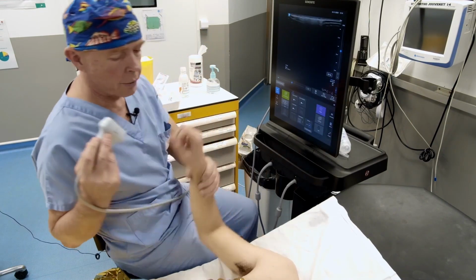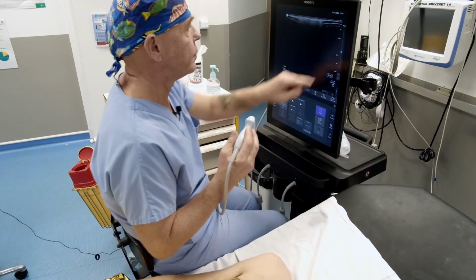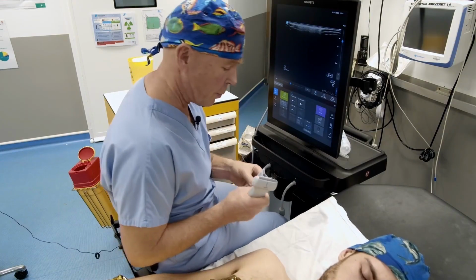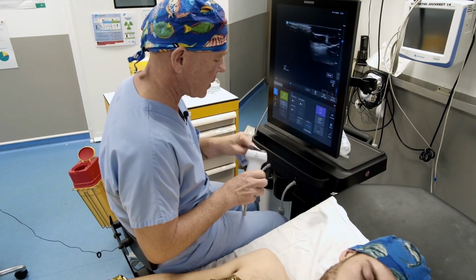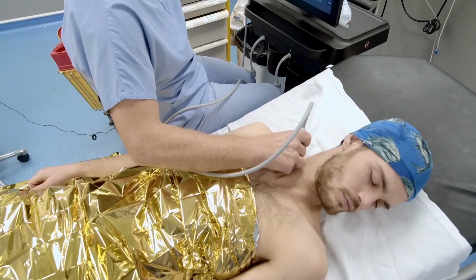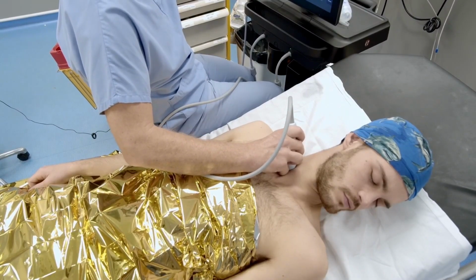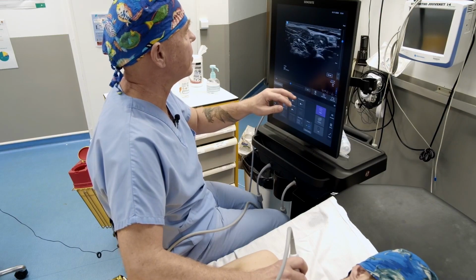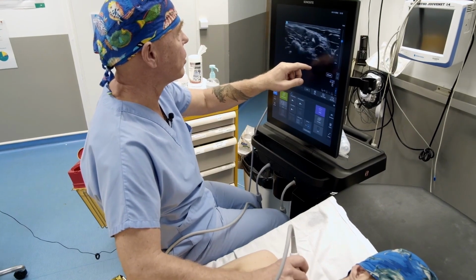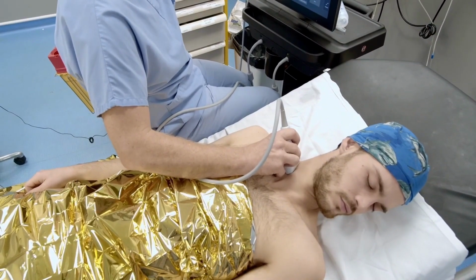So we'll move right along to the upper limb blocks, starting with the interscalene block. For the interscalene block, it's quite simple. You start from the clavicle. You place your probe against the clavicle and move upwards. Here we're live, you see there it is. So we use the landmarks that we saw right at the beginning: the anterior scalene, the middle scalene.